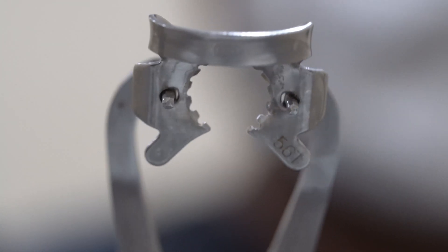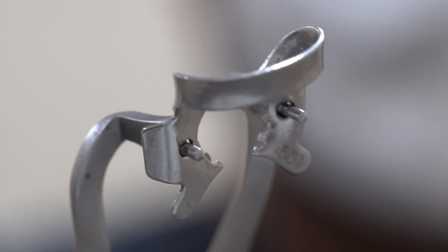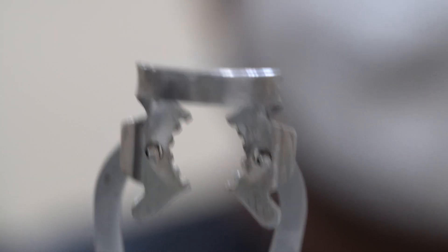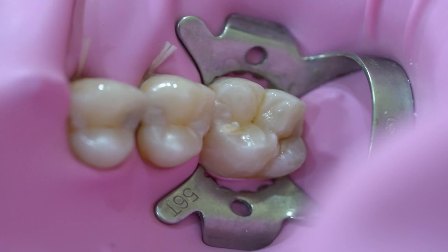The only clamp I use for 90% of my isolations is the 56T clamp — or 56Tiger clamp — from KSK. It has become my go-to clamp for almost any procedure: restorative, endodontic, cementation of E-max crowns, bridges, lithium disilicate restorations, whatever it may be. It can be used on any molar as long as you have sufficient buccal space, and it is a winged clamp, which is why you need that buccal space.